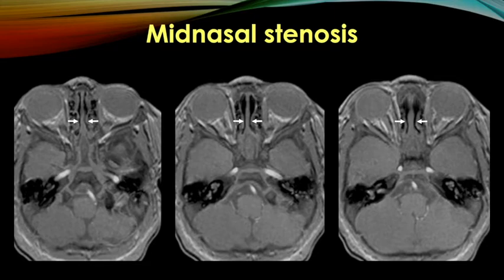ZTE can also be used to evaluate the sinonasal cavity. So here's a patient who had some trouble breathing, and you can see, as delineated by the arrows, that there was bilateral midnasal stenosis.